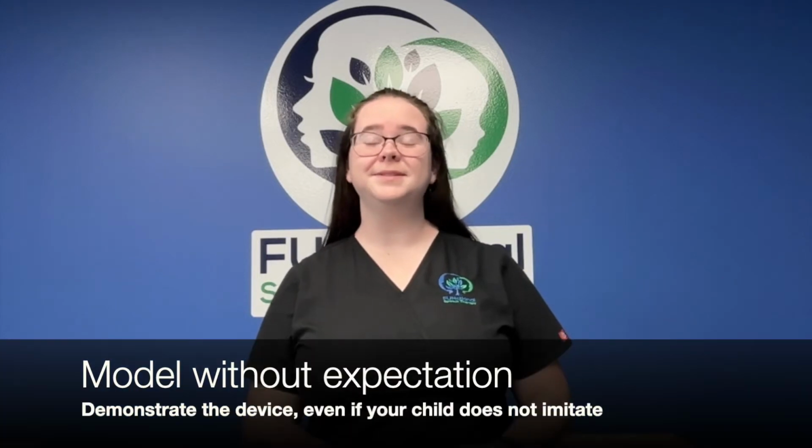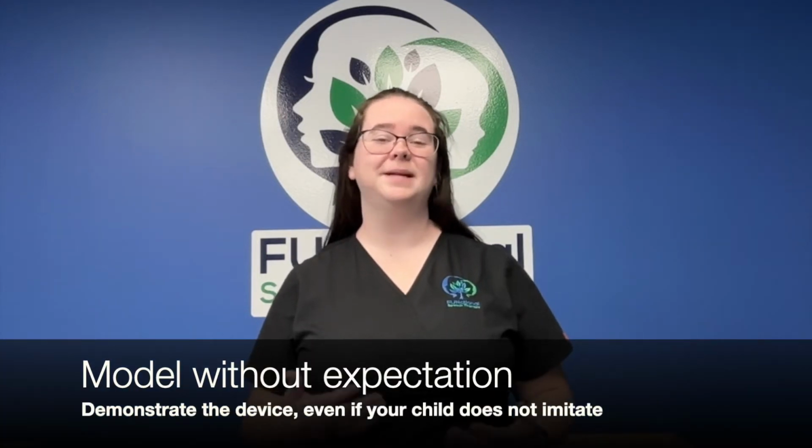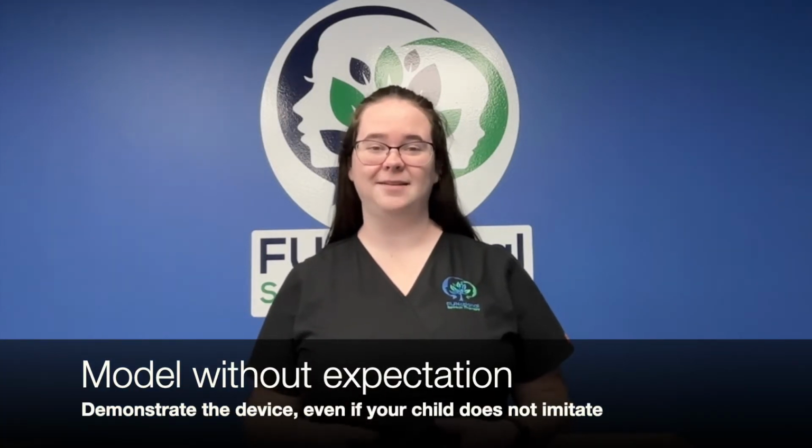Tip 3, do not expect your child to respond or imitate you, especially not right away. In the beginning phases of AAC use, our role as the child's adult is to demonstrate the device as frequently and in as many settings as possible.